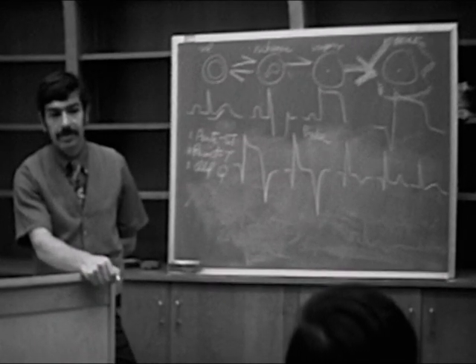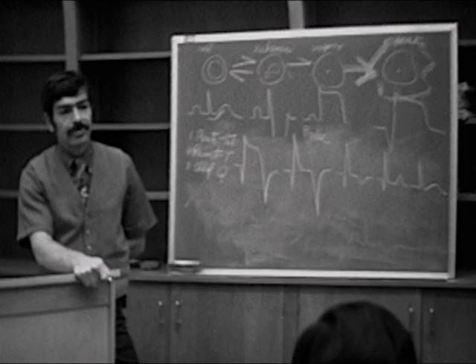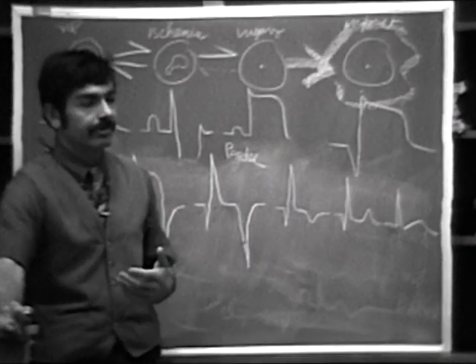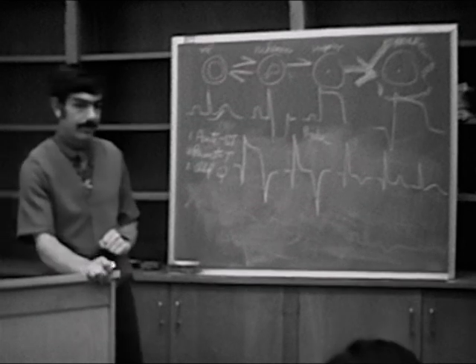Months, right. It does stay months. Average of 4 to 6 months. But again, this is just a very rough estimate because there are people who will be upright again in 6 weeks, and there's others who, in the course of the rest of their lifetime, their T waves will never come up. Right? So this is just an average.